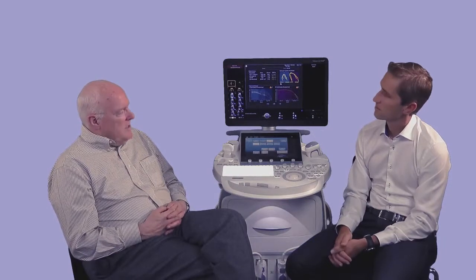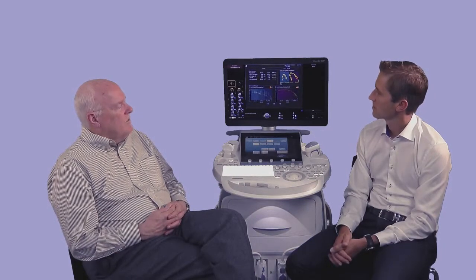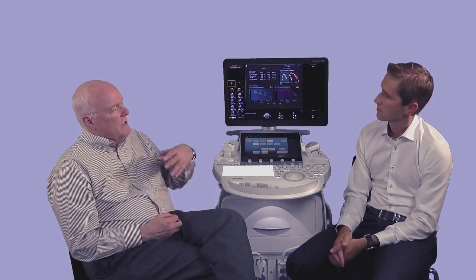The maternal-fetal medicine crowd, I think, will find this very beneficial, especially when you're looking at fetuses with twin-to-twin transfusion risk, growth restriction, fetuses of mothers with diabetes. We're actually doing a study now where we're analyzing heart 4-chamber views of women in labor of the fetal heart, and we think there will be information there about who would have an abnormal heart rate tracing based upon the analysis. There's lots of applications there.